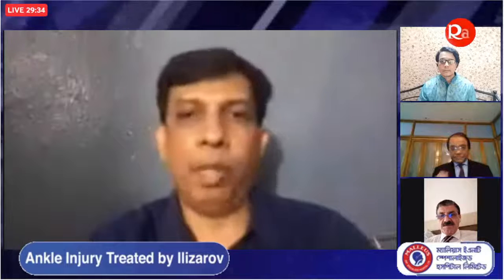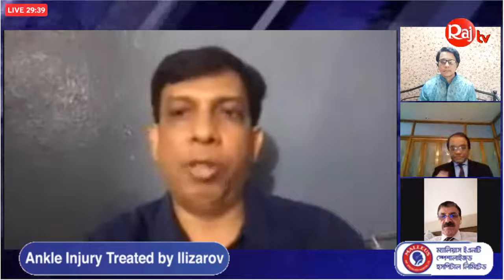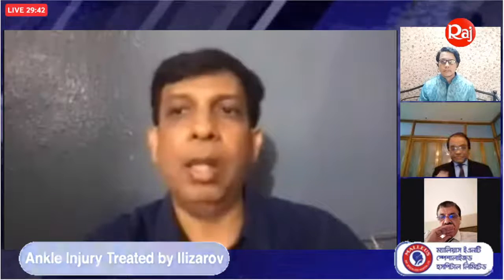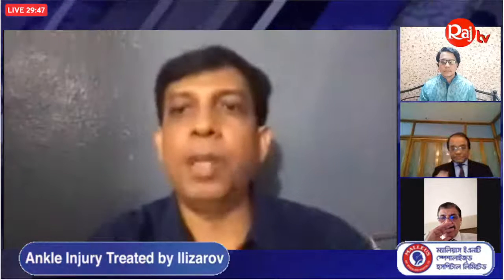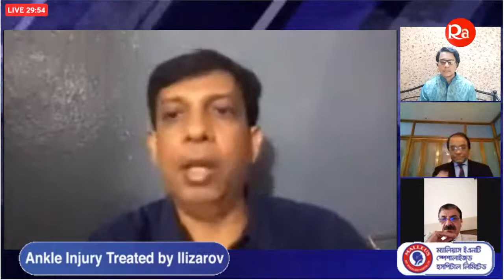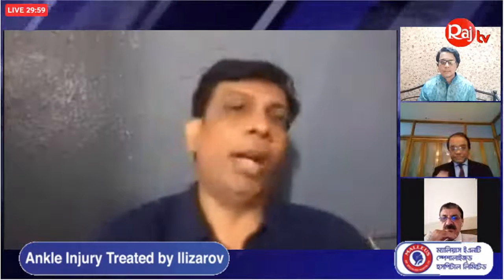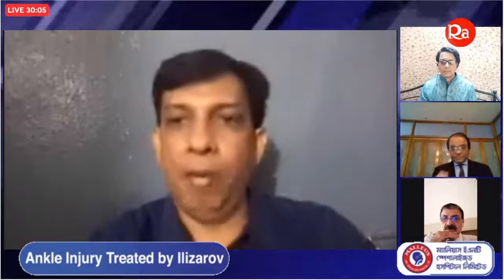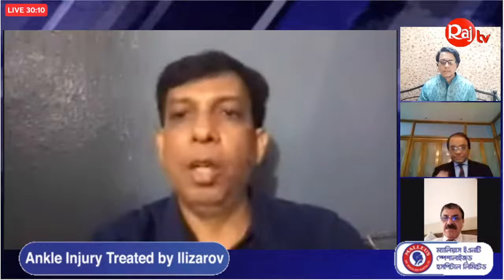When fixing the ankle fracture with Ilizarov, we have to take care of a few things, like whether there is a compound injury or not. We have to see the adjacent bones, the ligaments, soft tissue, and vascular status is very important. For reduction, we have to take care of the mortise, articular surface congruity, the tibiotalar joint. We can span with the foot ring also. We can reduce the malleoli with olive wires, and for oblique fractures, with olive and counter olive wires. We can always do soft tissue procedures, as Bari sir said, a flap or skin graft as needed.